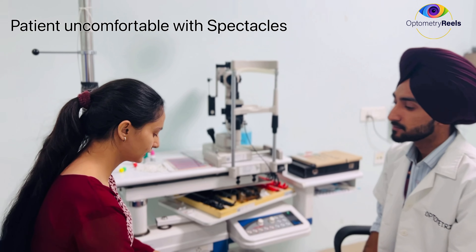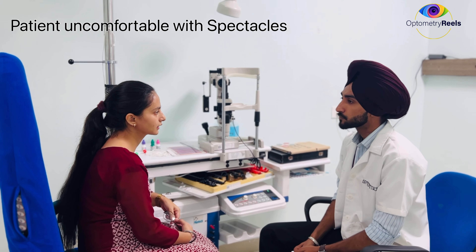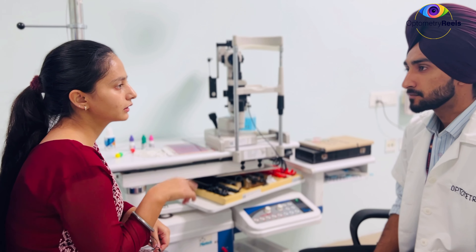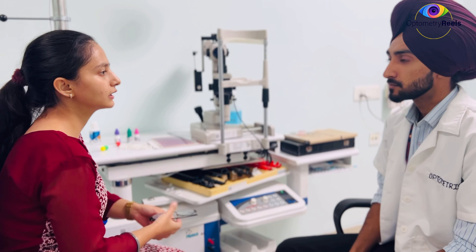So recently I had to get these glasses. I am not feeling comfortable with these glasses. What problem are you having? While seeing with one eye — a single eye — I feel comfortable. While seeing with both eyes, I feel headache and eye strain, especially while reading.